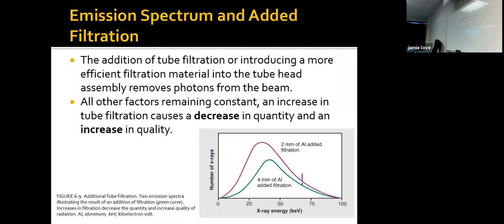So look at the foot. The toes are really, really thin, not a lot to them, but the heel and the arch of your foot getting towards the tibia and the fibula where your leg is and your calcaneus, all that's really thick. So see how the high energy waves are coming through the thick part, the low energy photons are coming through the toes. So with that thick wedge that we added, that filter, it's getting rid of some of those energies so we don't burn out the toes.